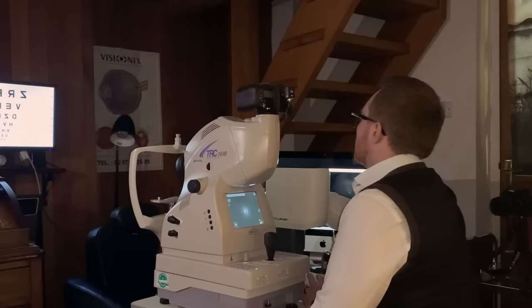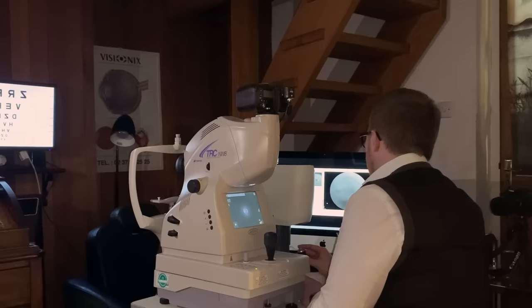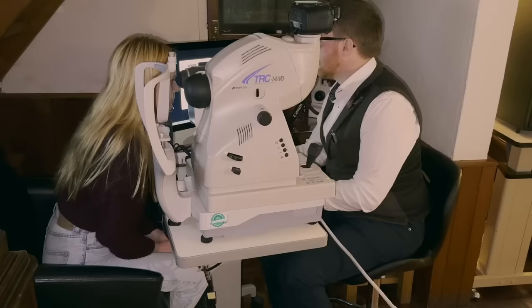Okay. Looking straight ahead, you're going to see a little light straight in front of you. There'll be a little white light and a little red light. I'm going to get you to look at the little white light directly in front of you. Very good. Nice big wide stare for me. It'll just be a bright flash. Good.